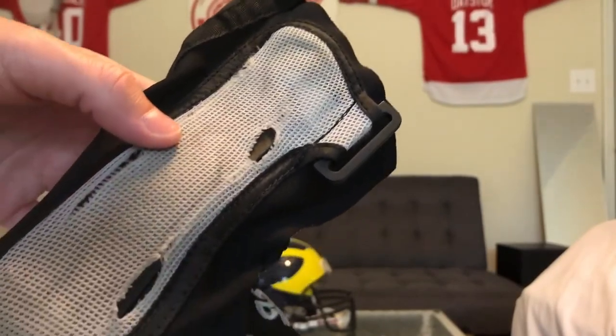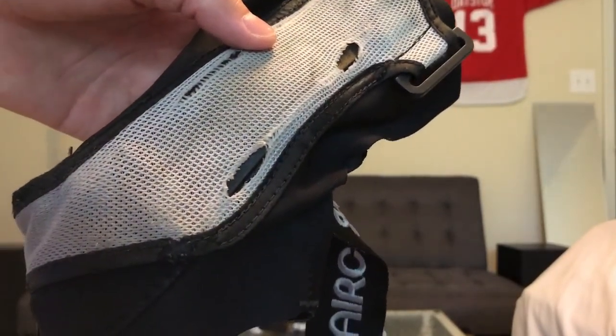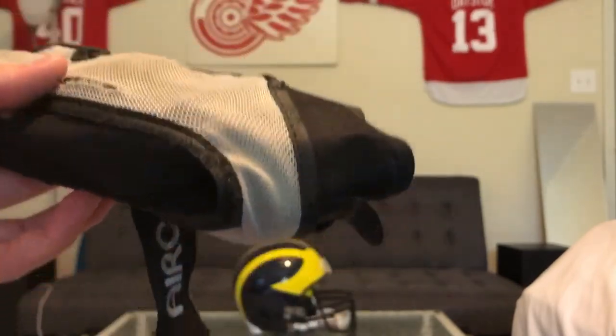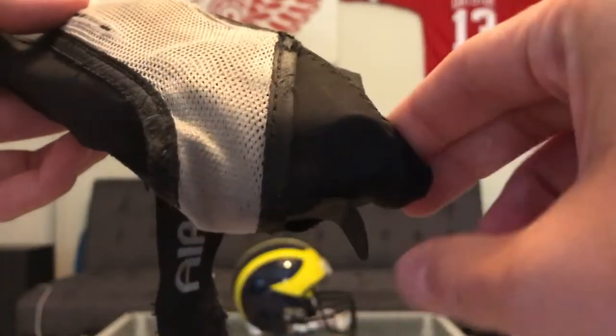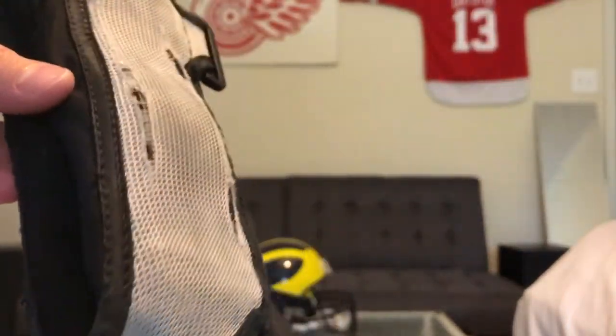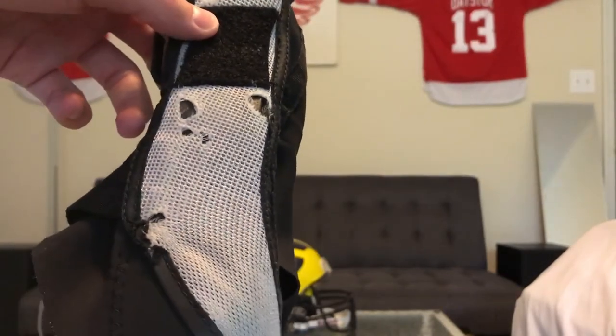As you can see from the b-roll I'm showing now, I have beat this thing to death. I wore it for about three months, every time I hooped — that's indoor and outdoor. For how much I've worn it, it actually held up pretty well and it's still completely functional.